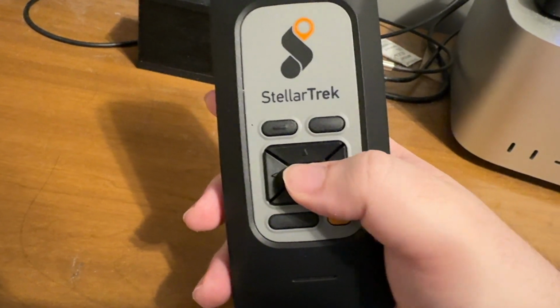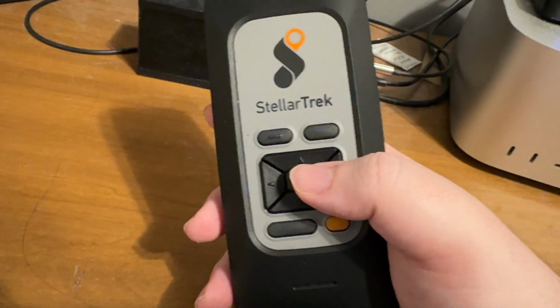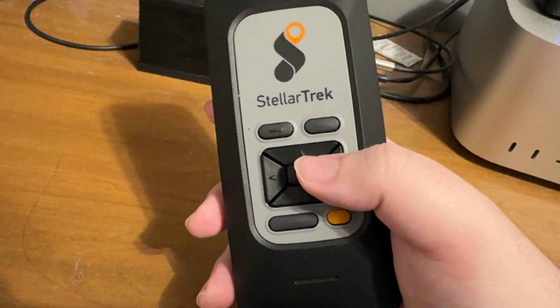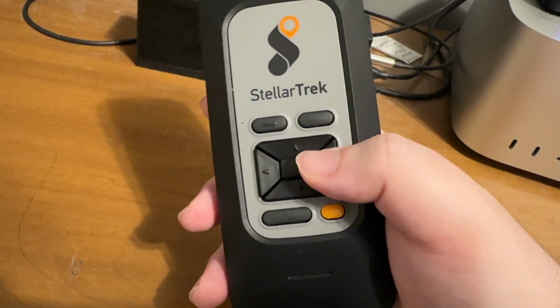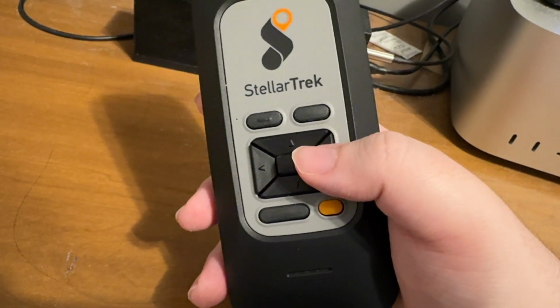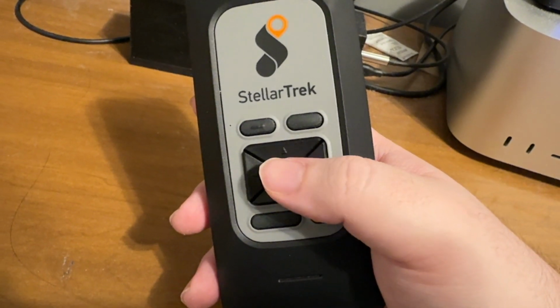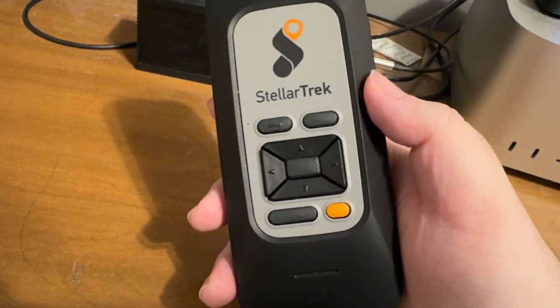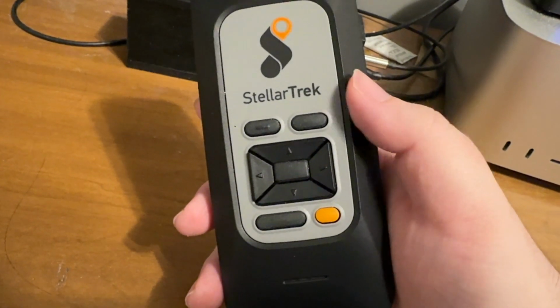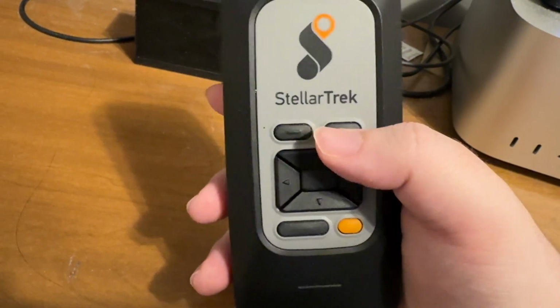If I press confirm, keyboard layout, English QWERTY. We're in the menu now. Press confirm to select this value. If I press the right arrow key, English ABC, and press it again, English QWERTY. Press confirm to select this. Now it's going to tell us configuration value already selected, no change required. Regional settings. Keyboard layout, English QWERTY. So English QWERTY is selected.